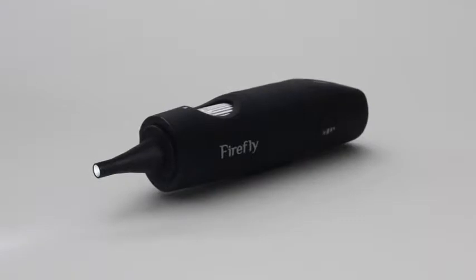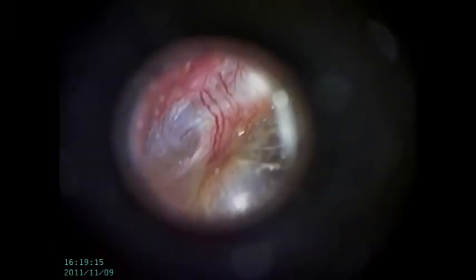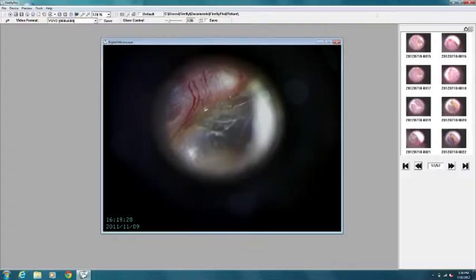The DE550 achieves excellent image quality and depth using an LED light source, multi-layered optics, and state-of-the-art image processing technology. The video otoscope has a range of up to 30 feet and runs on a built-in rechargeable lithium-ion battery that lasts for over 3 hours of continuous use.